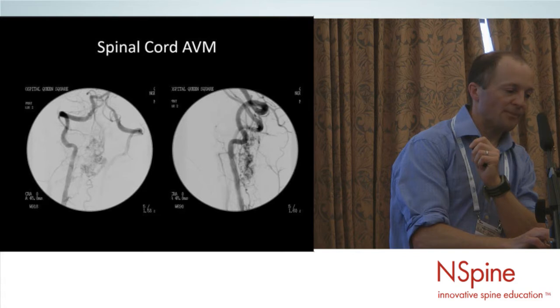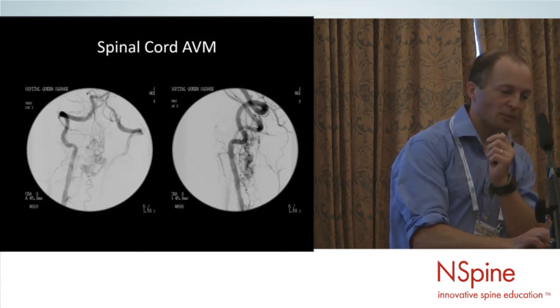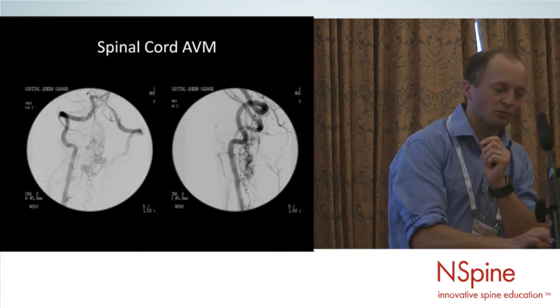And this is the end result. Very difficult to completely exclude these angiographically as well. And this patient went on to have a few subsequent treatments, but we're still left with a residual.